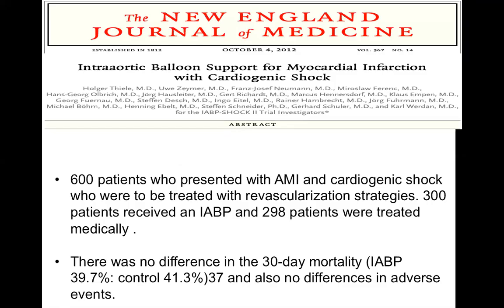Sometimes you said it's not recommended to use it as a prophylactic, but in practice we use the intra-aortic balloon pump in patients with a tight left main or low ejection fraction going for surgery, before induction of anesthesia. I meant in a routine prophylactic way, just in case. Yeah, you're right, Yanni.